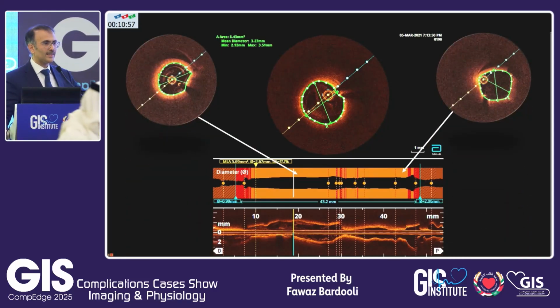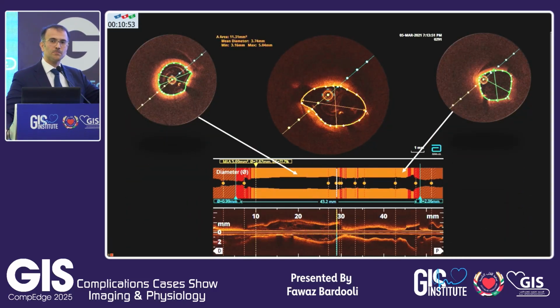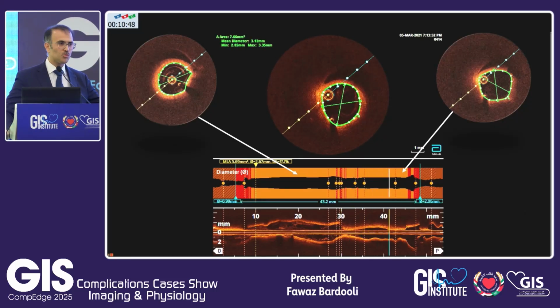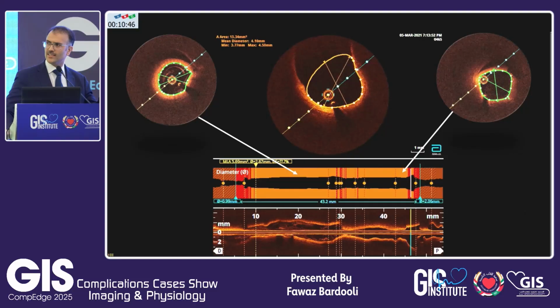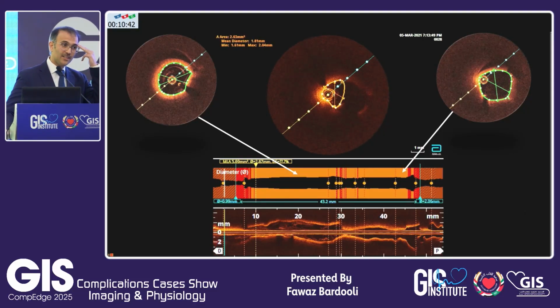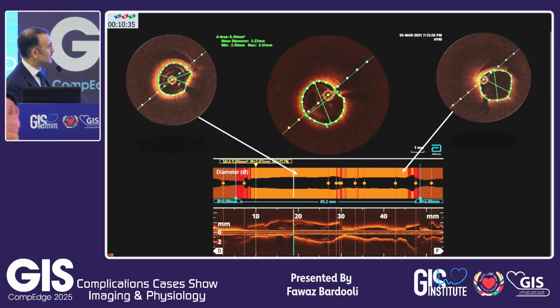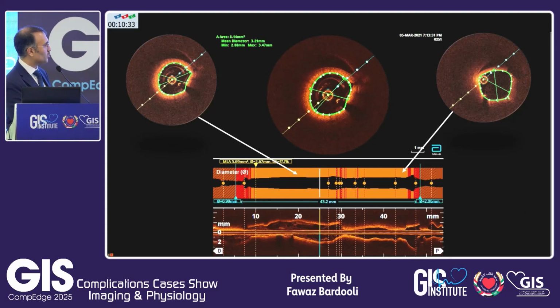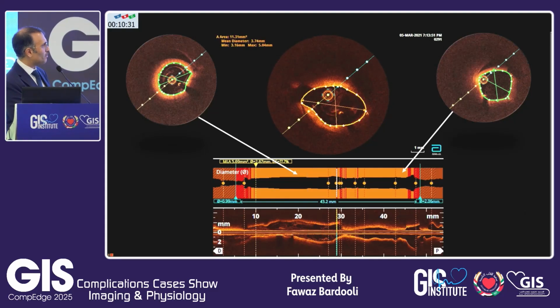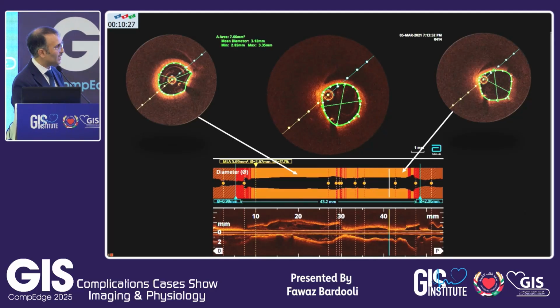So one thing, at least if you did not see what is the pathology, you should expect a clot. And there was no clot. There was only some swirling of blood. And the intima media were actually very nice. It does not go with the plan that you have in your mind, that this could be an ACS presentation with a clot. So what you can see is that you have the intima media adventitia quite good, and you have a black discoloration at the back of the vessel. And that is the hematoma.